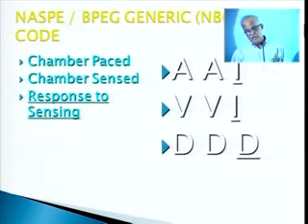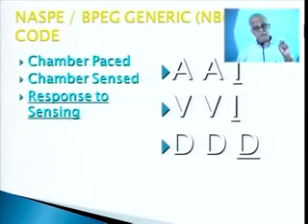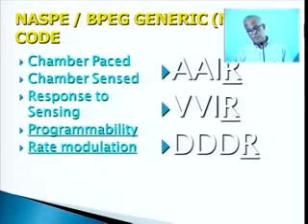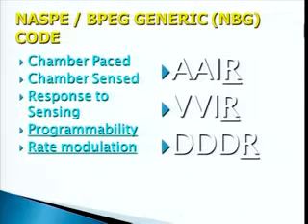So with that, I means inhibited. If the pacemaker is sensing properly, it inhibits, so it doesn't give a stimulus. So you will have inhibited, D means dual, it could be inhibited or it could be triggered. Whenever you need, that kind of pacing is also there. Then programmability. The newer programmable pacemakers have programmability where you can program the rate, the output, the refractory period, and other things. All can be programmed externally with the programmer.